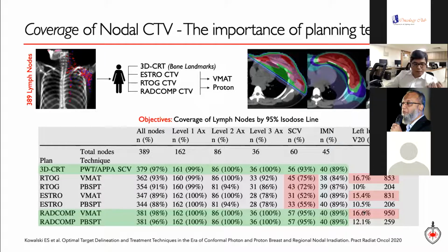So when I showed this to Dr. Kundan, I was like, look at this, we should just be doing 3D. But what he said was that to achieve this with a 3D plan, you probably would have to increase the volume of your 3D planning to a lot more, and have a lot more uncertainty. And therefore, this probably means that with appropriate attention to target delineation, it doesn't have to be an extensive target volume, doesn't have to be very sophisticated treatment planning. You can probably cover all of these regions very well if we follow certain planning priorities and institutional guidelines.